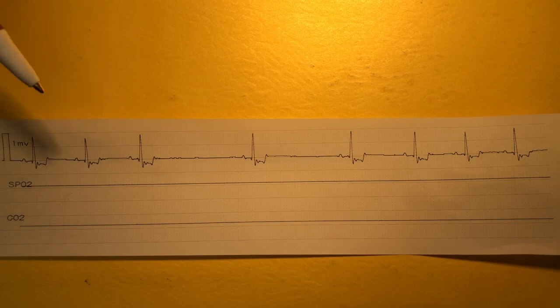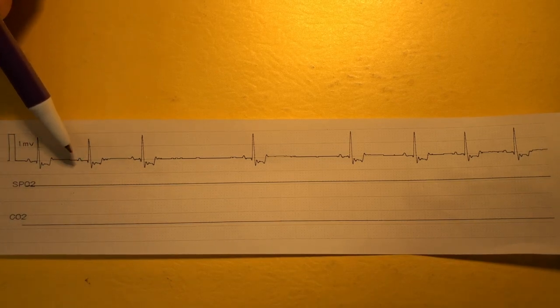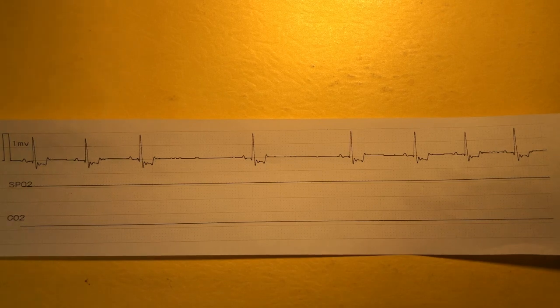So our QRSs would be normal and upright, as is shown here in Austin's reading. A ventricular origin complex arises from the ventricles itself, which is not the normal conducting pathway and would look odd on our complex here. It may appear as wide and bizarre shapes on our QRS complex.